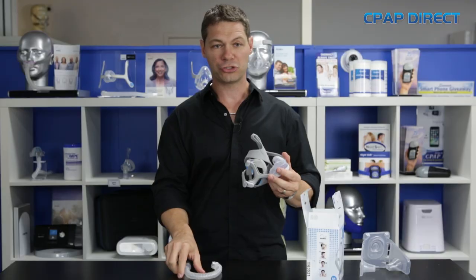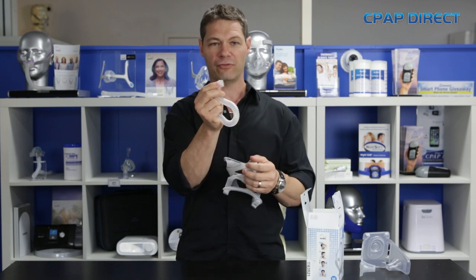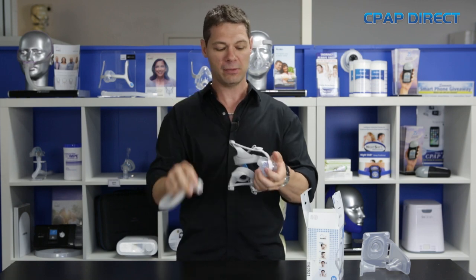It also uses a short tube, very similar to the N10. The short tube has a clip on it, which is designed for easy release if you're going to the bathroom in the middle of the night.